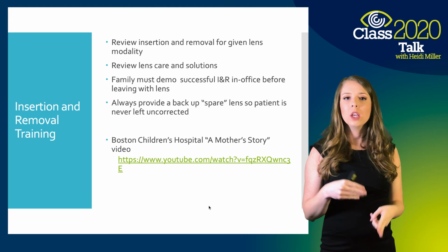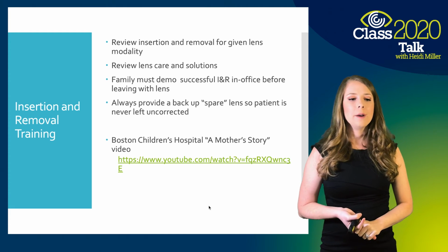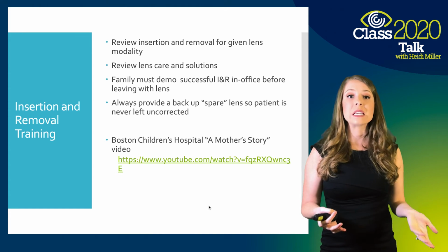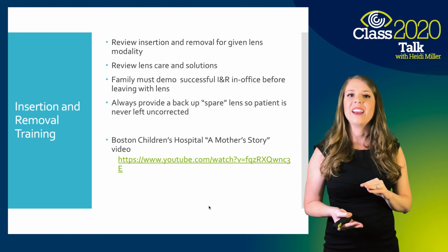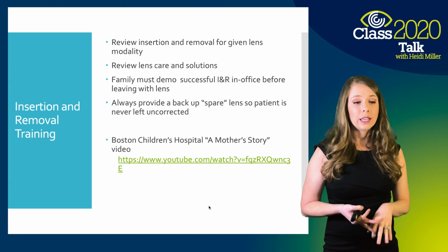For a gas perm, you can recommend any sort of GP solution that you want, including ClearCare. But whatever's your preference, I would just keep in mind that there may be some times when the lens is dropped, so make sure it's something that they can do in the moment and not only one option that requires at least 6 hours for cleaning.